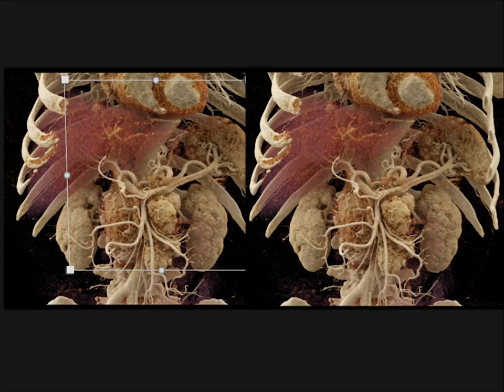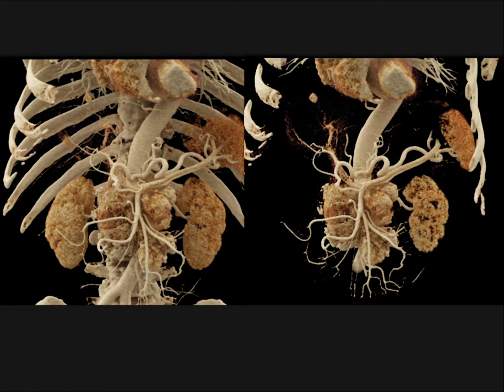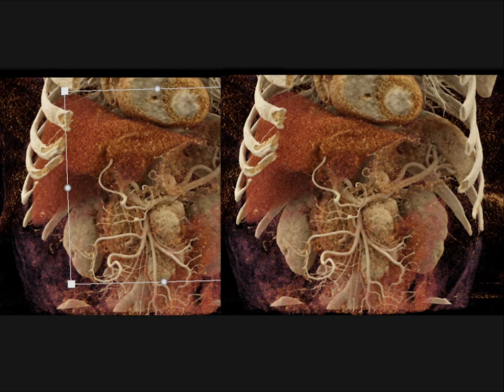Now, the surgeon wanted to operate on this patient, so we gave them some images. Look at the cinematic. Portal vein, splenic vein, SMV. Look at the large, bulky masses, those large nodes really infiltrating around the vessel. You can see it very nicely here, the branching of the GDA. You can see the vascular map of the venous, the narrowing of the portal vein, splenic vein, SMV confluence. The vessels are patent, but you can see how extensive and how large the tumors are.